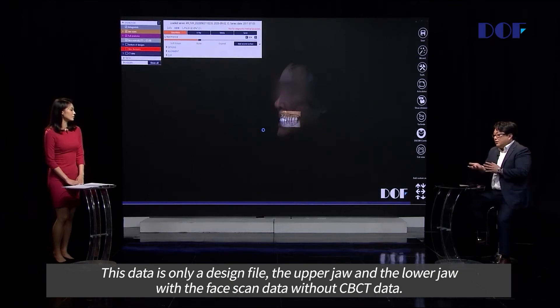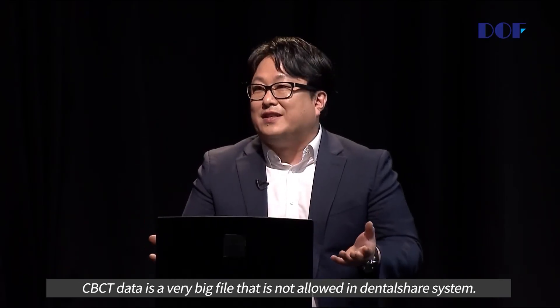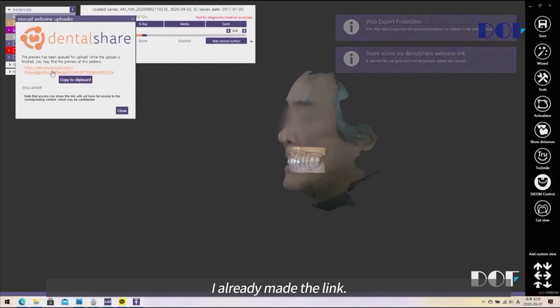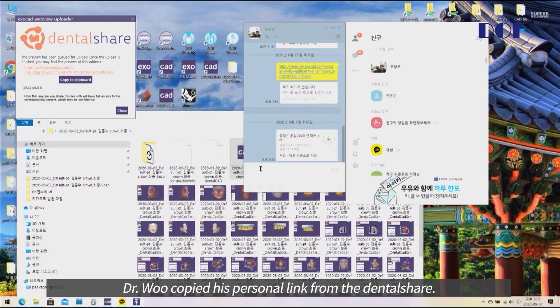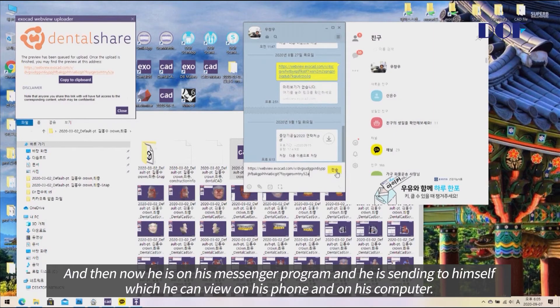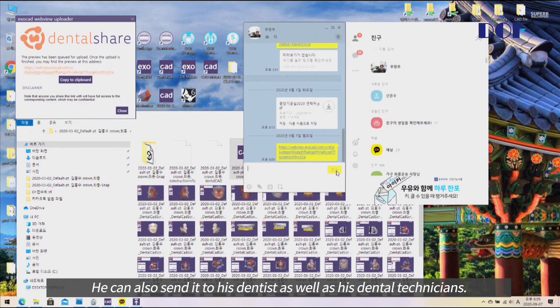This data is only the design file, upper and lower jaw scans, and face scan data — without the CBCT data, because CBCT data is a very large file and is not allowed in the dentalshare system. A link has already been made and copied to the clipboard. Dr. Woo copied his personal link from dentalshare and is now sending it to himself via messenger, which he can view on his phone or computer. He can also send it to his dentist and dental technicians.